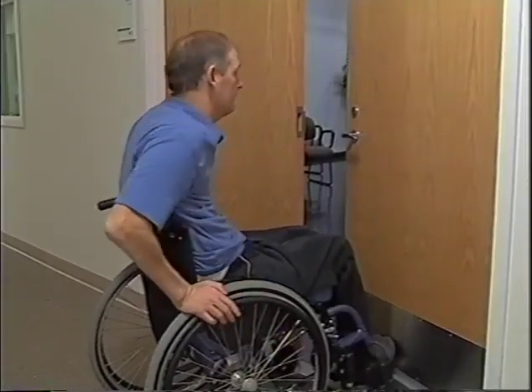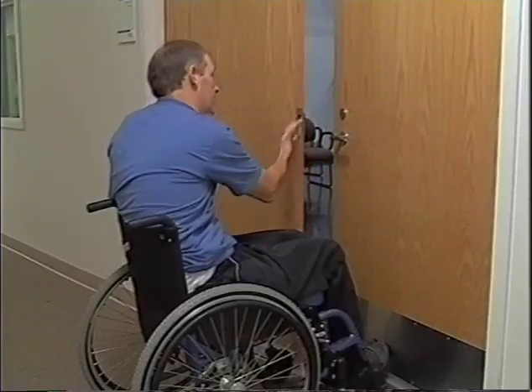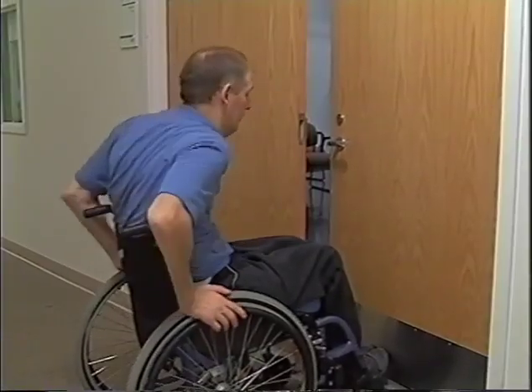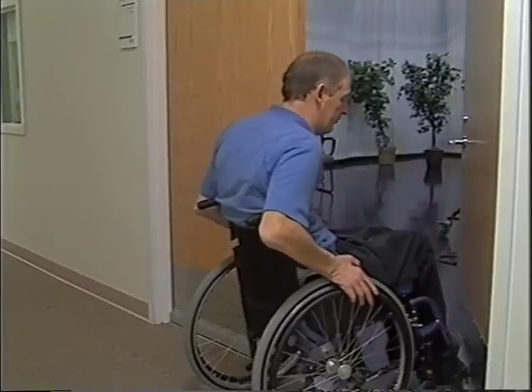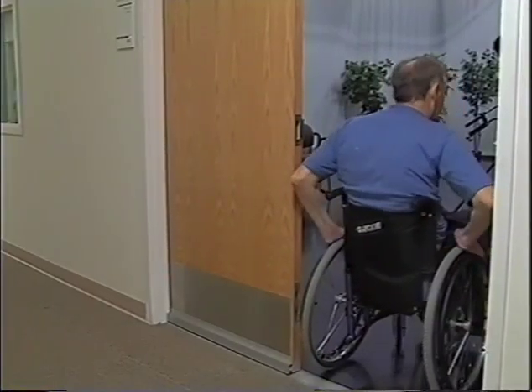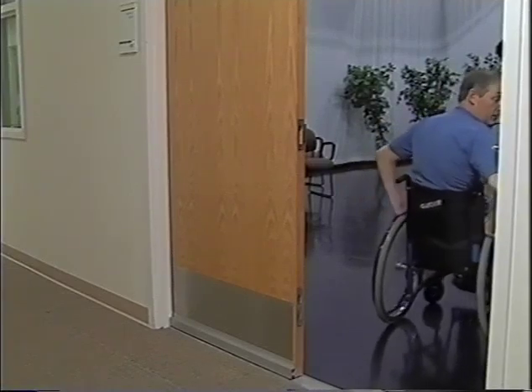Okay? Once you come up to the door, come at a bit of an angle because this door is going to be pushing your front end over to the left here, and I don't want you getting hung up on the door jamb of the other door. So a little bit of an angle, try to stay out as far as possible to give yourself as much leverage as possible, and just keep pushing with the wheels. If you get in here and get stuck, you can use your elbow to keep the door off your wheels and come on through.